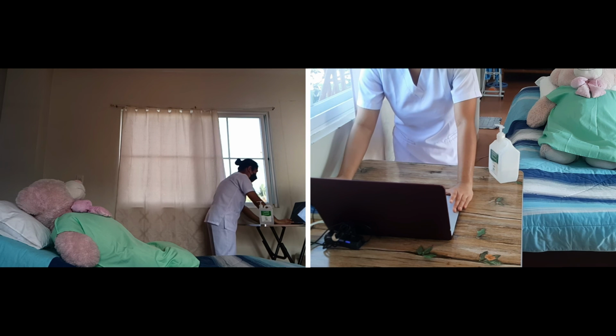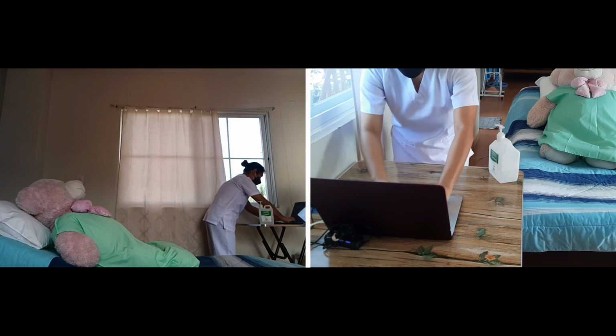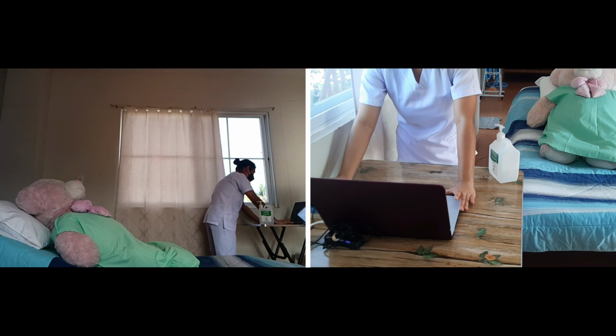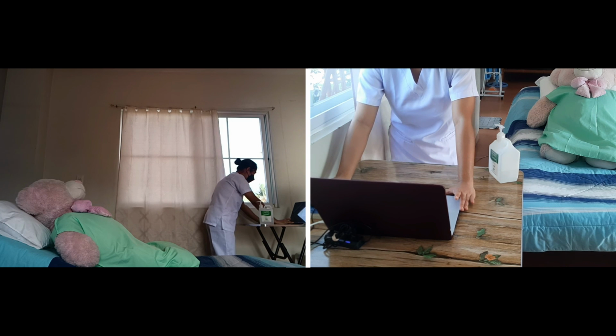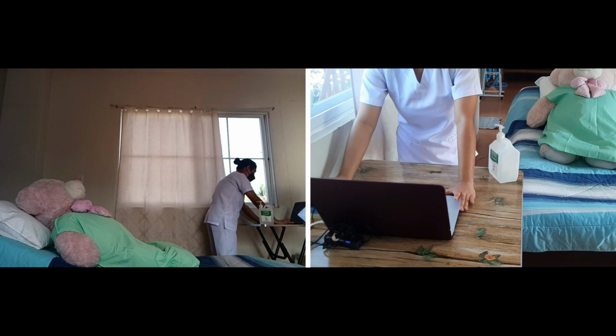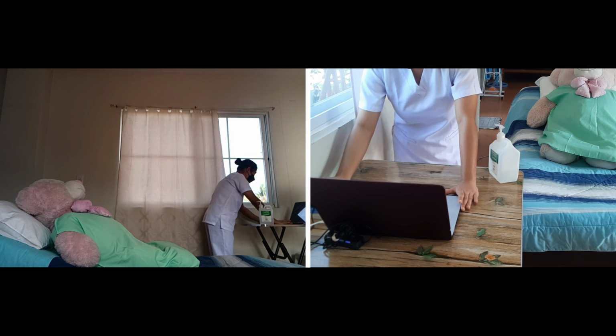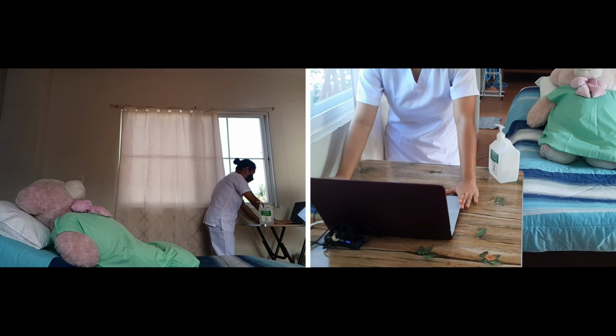The amount of fluid inserted in the balloon. The patient's reaction to the procedure. The amount and character of urine that is observed. The name of the person performing the insertion, which is me. The time and date it is completed.